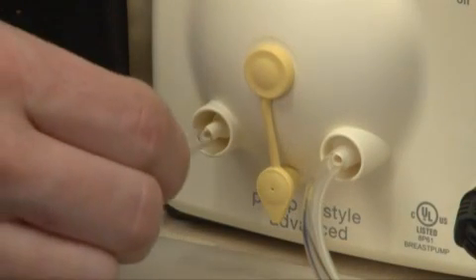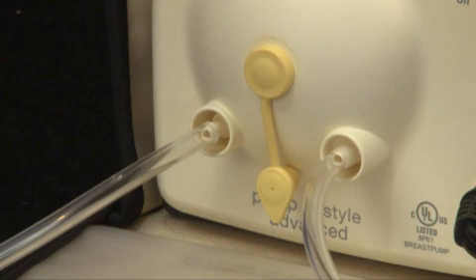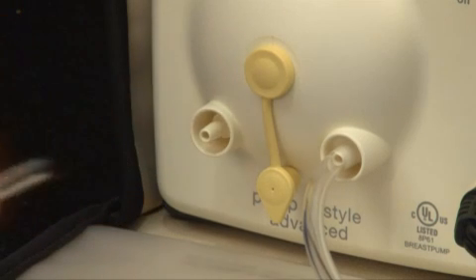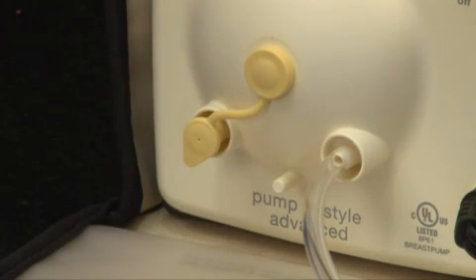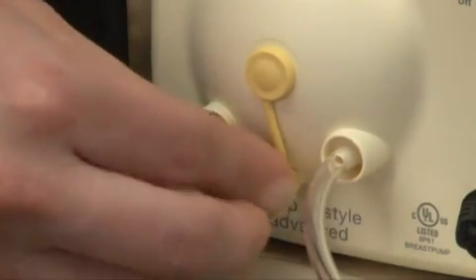Insert the other ends of the tubing into the ports on the faceplate of the pump. To remove the tubing, pull the tubing straight out of the tubing ports. Do not wiggle or pull the tubing at an angle. If you are single pumping, insert the port cap into the unused port on the faceplate. If you are double pumping, push the port cap onto the post at the bottom of the faceplate.